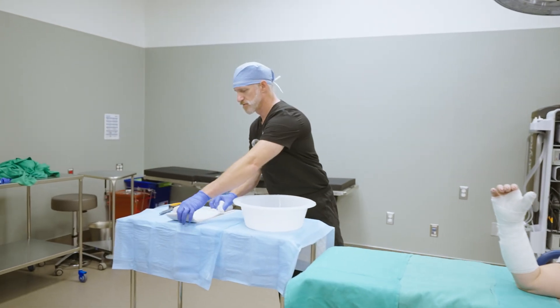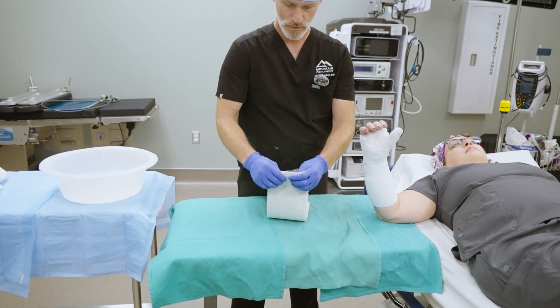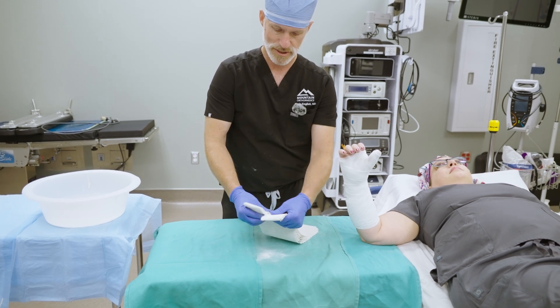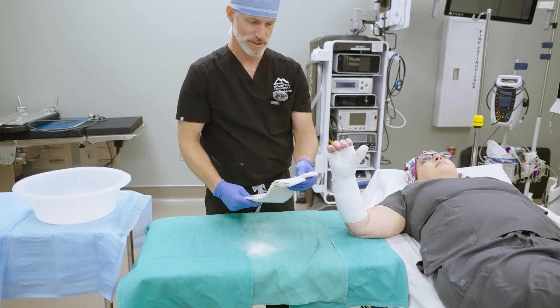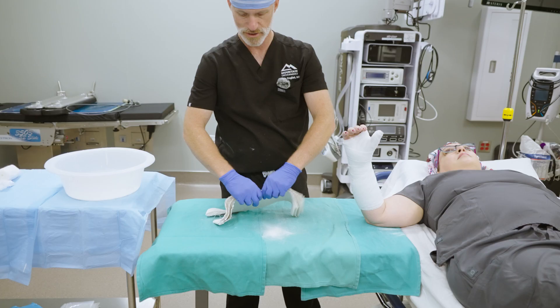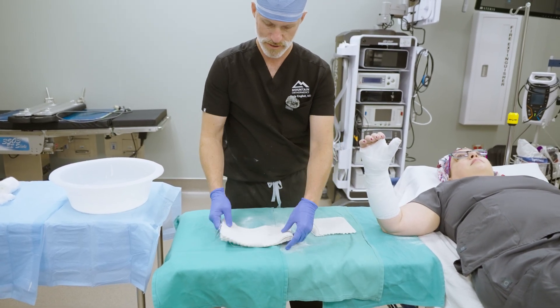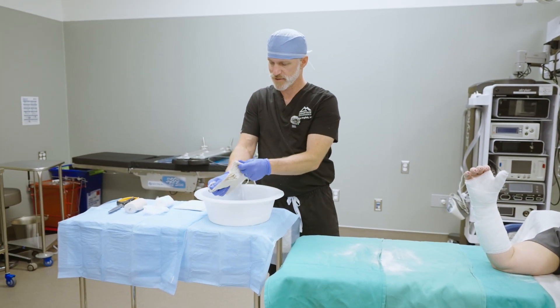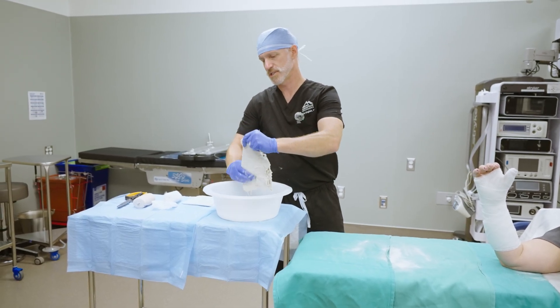The way I like to do the plaster: there are a lot of ways you can do it. What I typically do is split it lengthwise for the thumb, so I'll tear a spot and this will go on the front and the back of the thumb. Then I'm going to tear it to the length of the splint — you can measure or just estimate because you can always roll it back a little if needed. In the water with this, keep track of the ends, wring out the extra, and laminate all the sheets together.